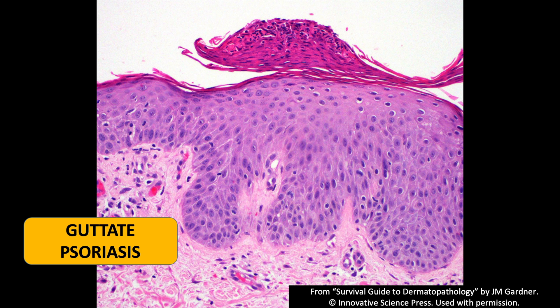Here's an example of guttate psoriasis, which has little tiny round patches and plaques clinically rather than the larger plaques most of you have probably seen. Guttate looks different, and accordingly, microscopically it doesn't usually have that classic elongated rete ridge acanthosis — it can be a lot more subtle. But you tend to see little mounds of parakeratosis with neutrophils, and that's what guttate psoriasis looks like — not the classic plaque psoriasis appearance.